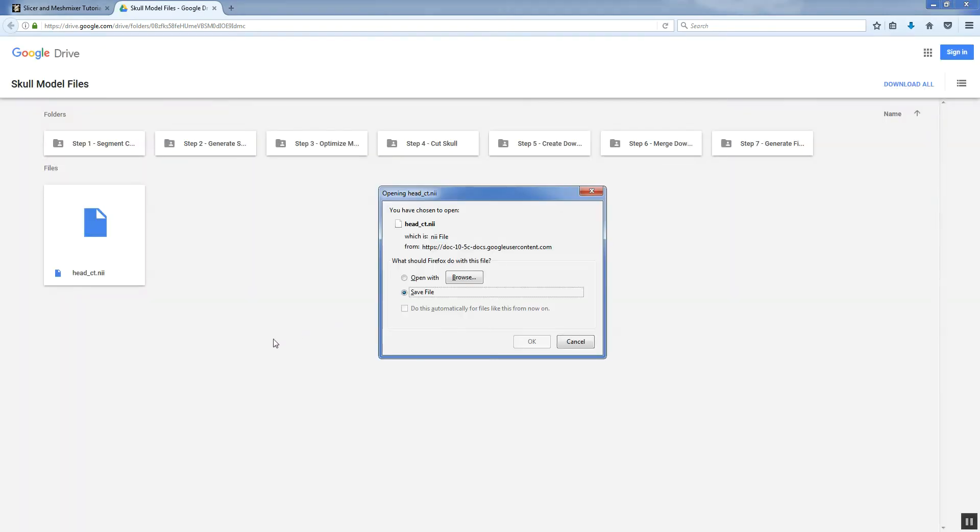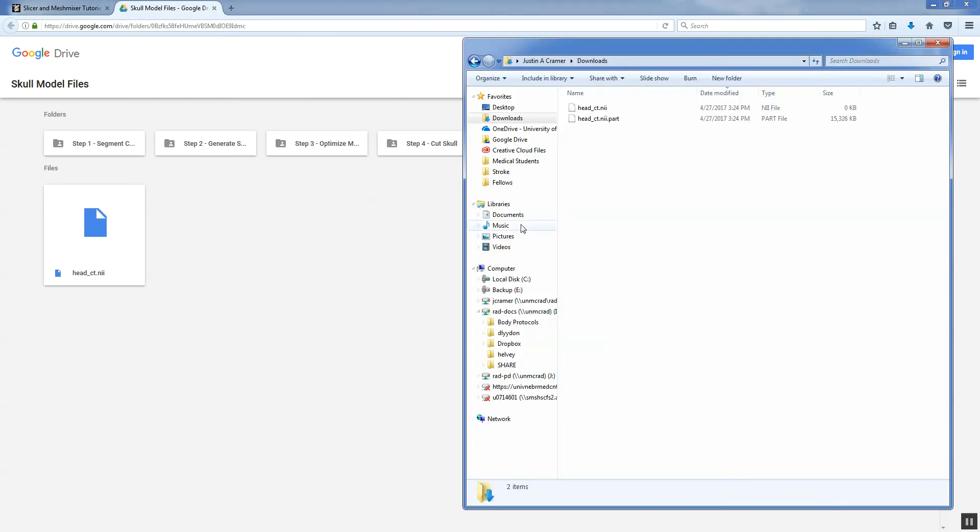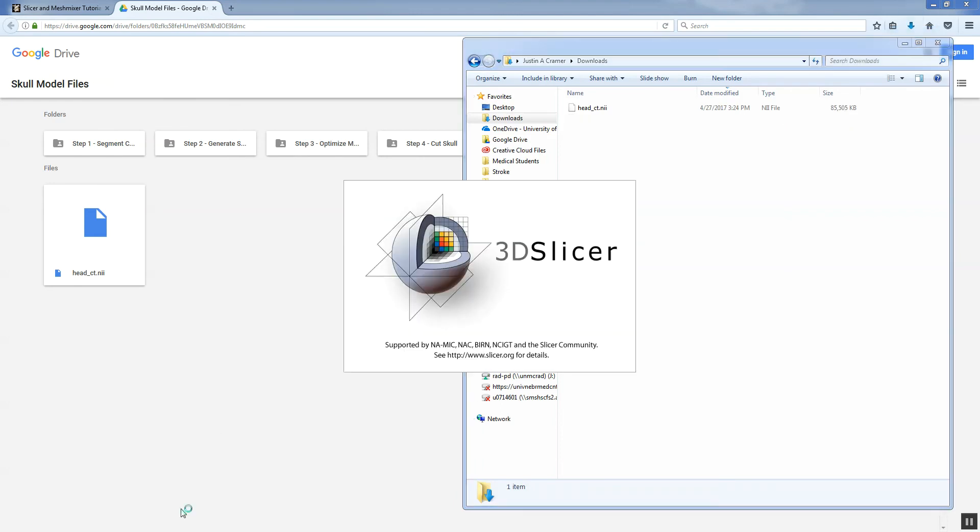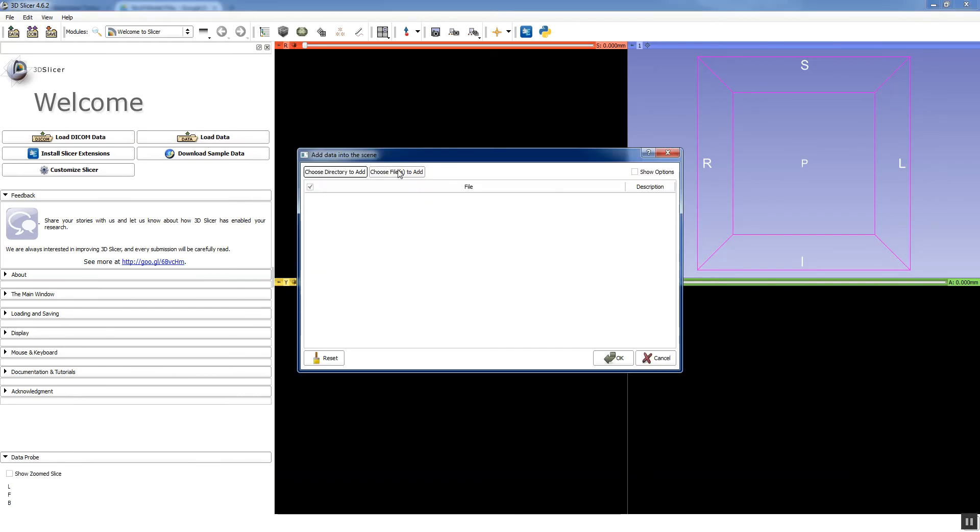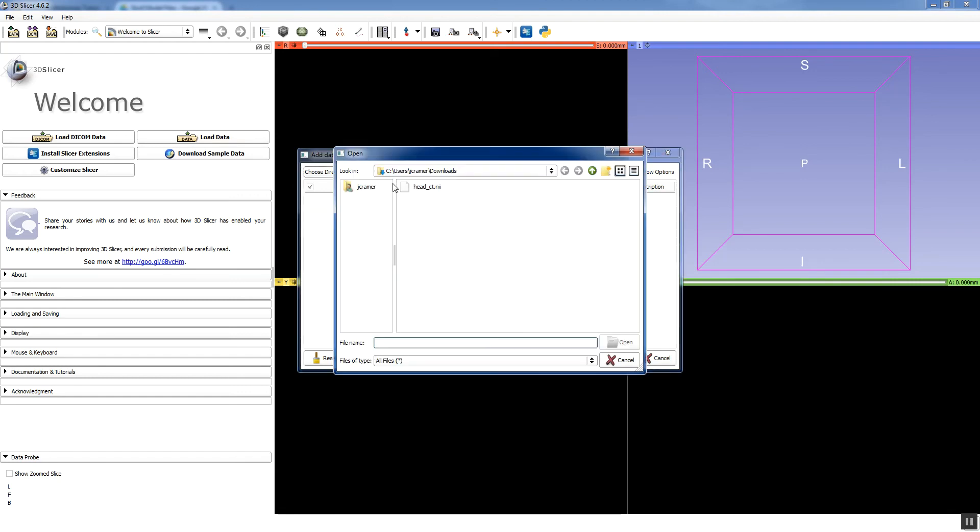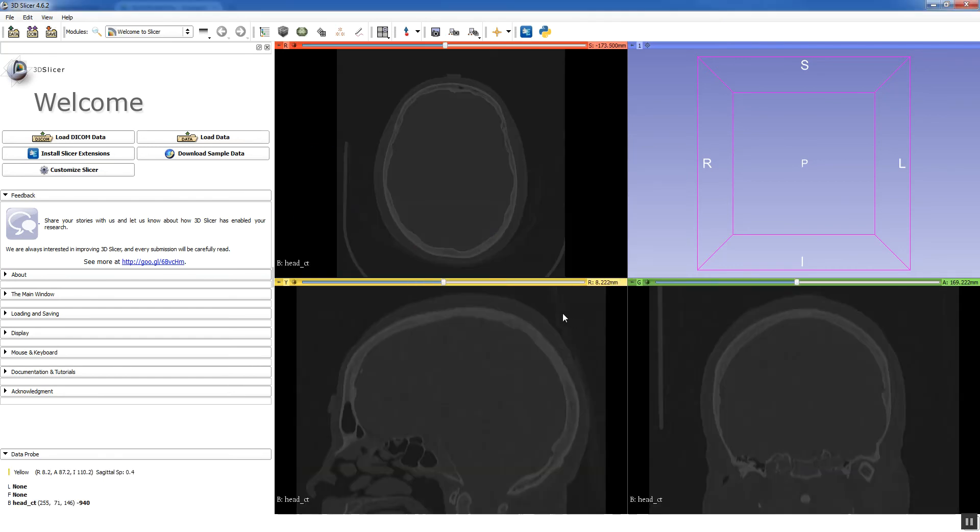It's about 85 megabytes, so it takes just a second. Once that's finished downloading, we're going to open up Slicer. Now I'm using Windows. Slicer and MeshMixer both work in both Windows and Mac. So either one is okay. You're going to go to load data and you're going to choose the file to add and browse the directory you downloaded it to. Click on headct.nii, click open and then click okay.